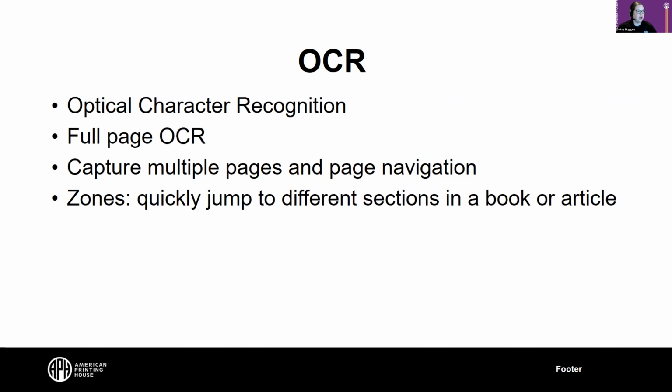Great, thank you. We had a few questions come in, some about the headphone situation, some about the camera. We know the Juno has a headphone jack. Does it connect with Bluetooth headphones? No. It has the headphone jack for a great purpose: use physical headphones that connect to your Juno. When rotating the camera, does it click into each view, or is it a continuous turn? It's a continuous turn of the camera.